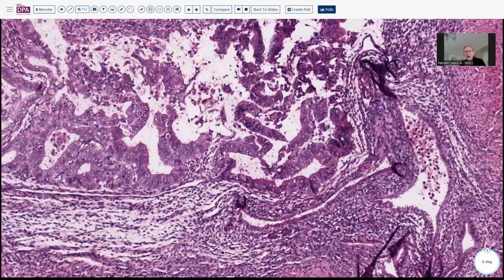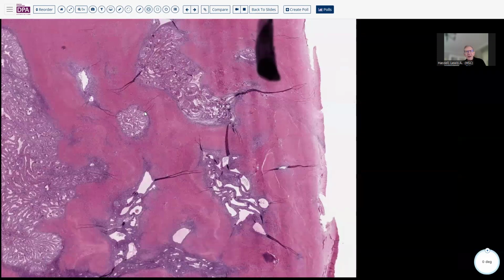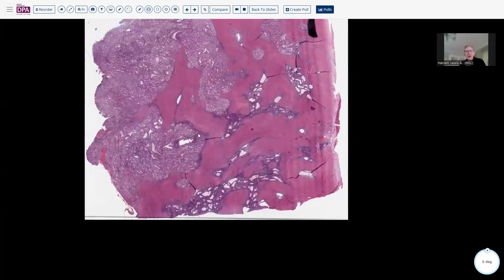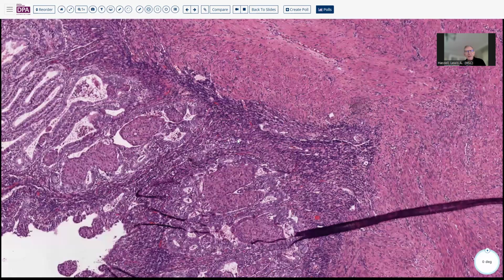And you can see the contrast between that associated with stroma. So this is actually endometrial adenocarcinoma that has extended down into adenomyosis, very deep, very close to the serosa, but is not, frankly, invasive. So anytime you can see things like that, you need to look and see, okay, do we have benign glands associated with this? Do we have benign stroma? And in this case, we do.